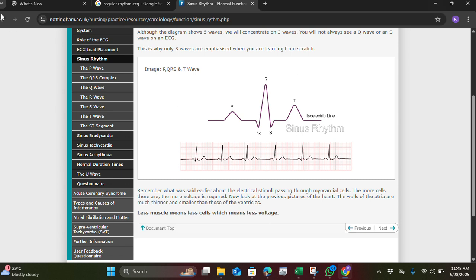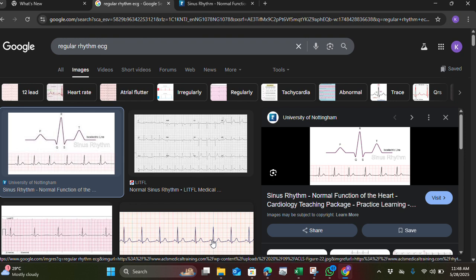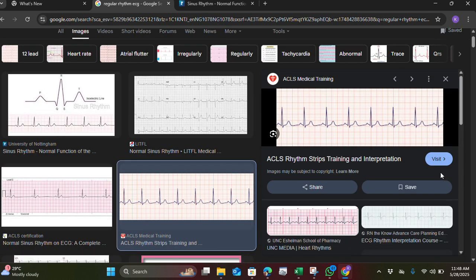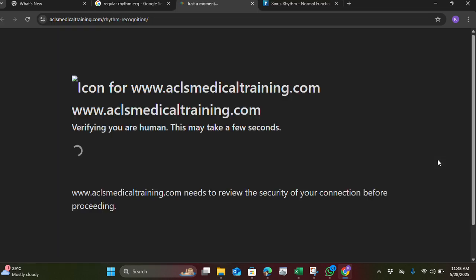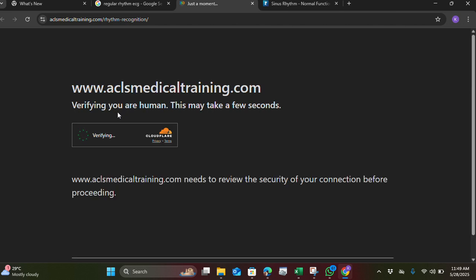So another criteria is also that your P wave must have a QRS coming after it. Your P wave must always have a QRS coming after it. Now let me show you what I mean. Because you know, normally after P wave is QRS complex, right? And so there are now issues where we have multiple P waves. That is irregular reading. For regular, after one P wave, the next thing you must see is a QRS complex.